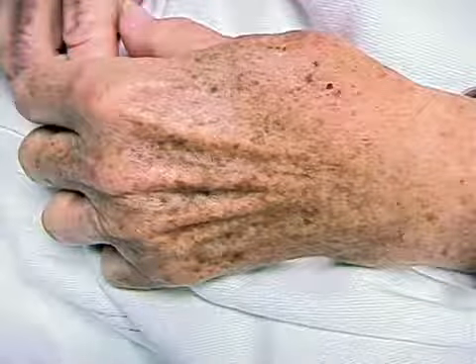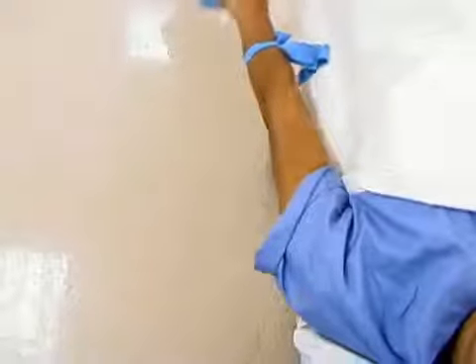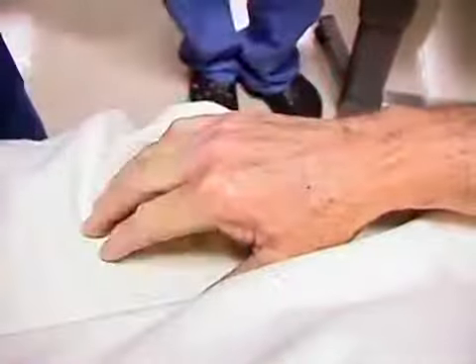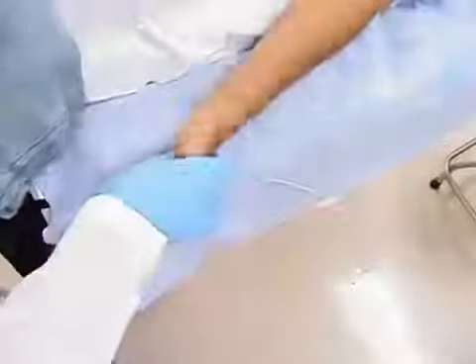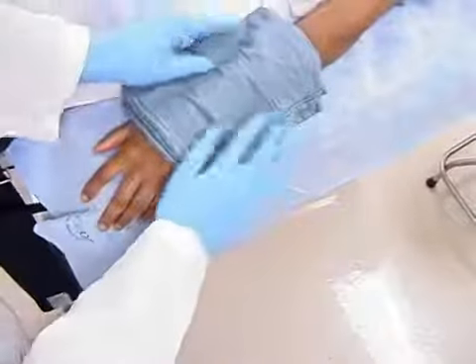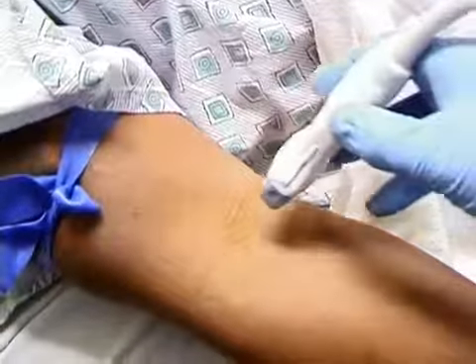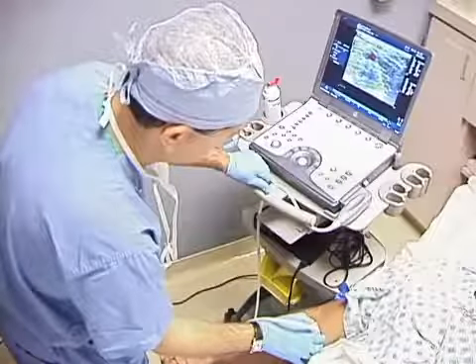When a vein is difficult to see or to identify on palpation, several methods can be used to increase its dilatation. These include lowering the arm below heart level, gently tapping on the vein, instructing the patient to open and close his or her fist repeatedly, and applying a warm compress to the selected site for 3 to 5 minutes to increase vasodilatation. Transillumination or ultrasound may also be used to help locate a vein.